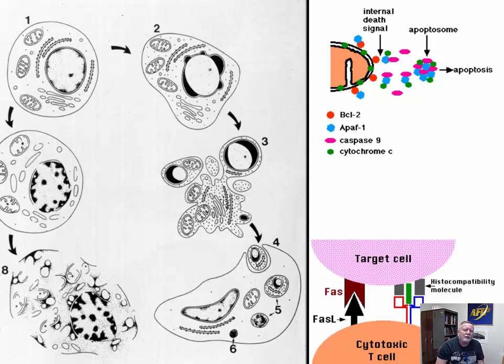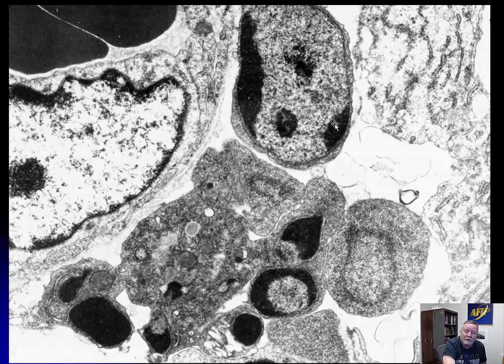Okay, I don't lecture on general pathology. There are a vast number of triggers for apoptosis, including the caspase cascade, including Fas ligand activation, and many more. And I will leave that to the people who teach on general pathology to explain that. But this is very characteristic, even on ultrastructure.